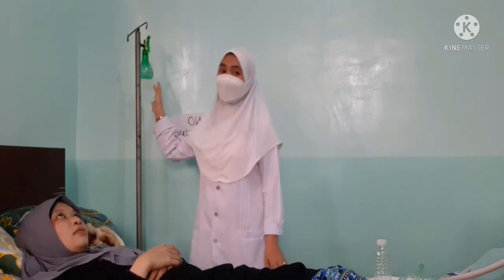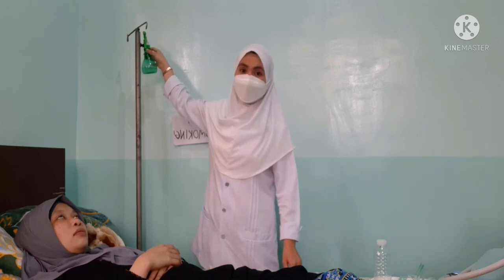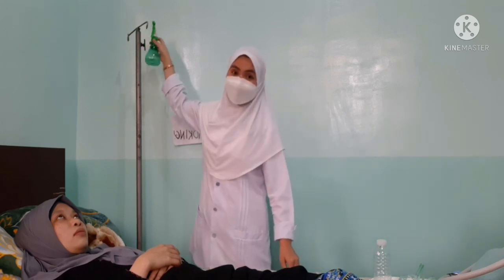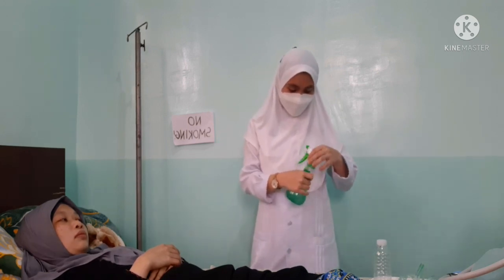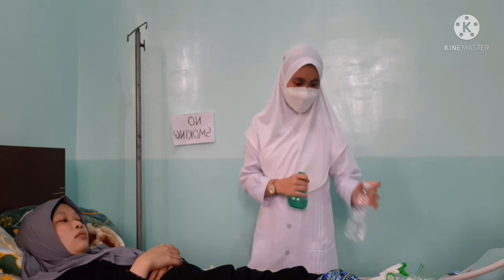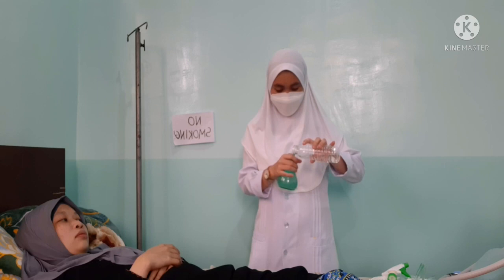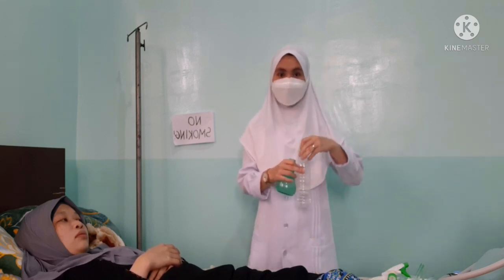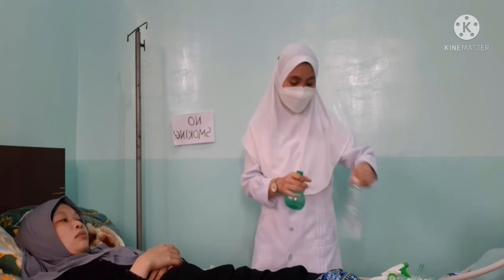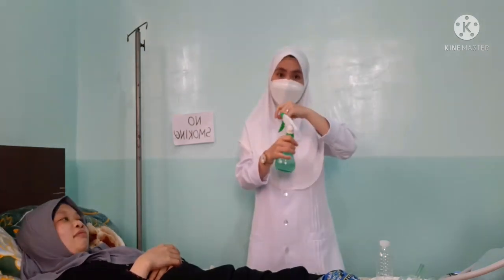So, this is our humidifier. We need to fill it with appropriate and sterile water. If needed, fill the humidifier bottle.